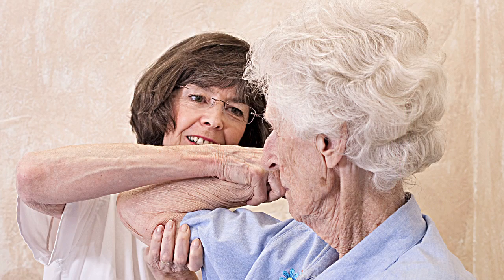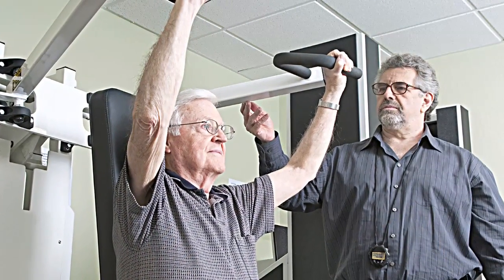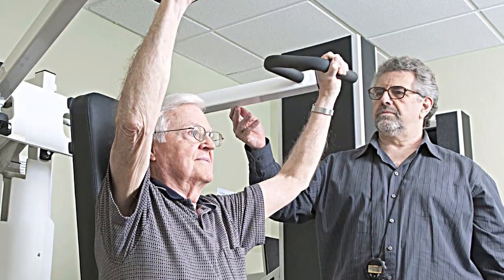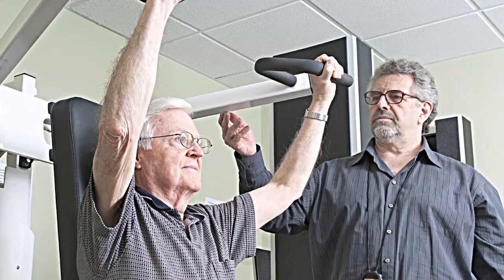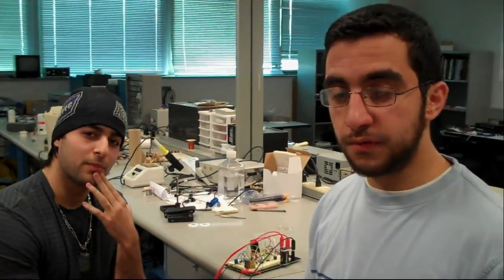While physical therapy can be costly and limited to specific office hours, this portable device can be a long-term solution and, more importantly, used in a very patient- and customer-friendly way. Now, Enes will talk about the electrical aspects of this product.